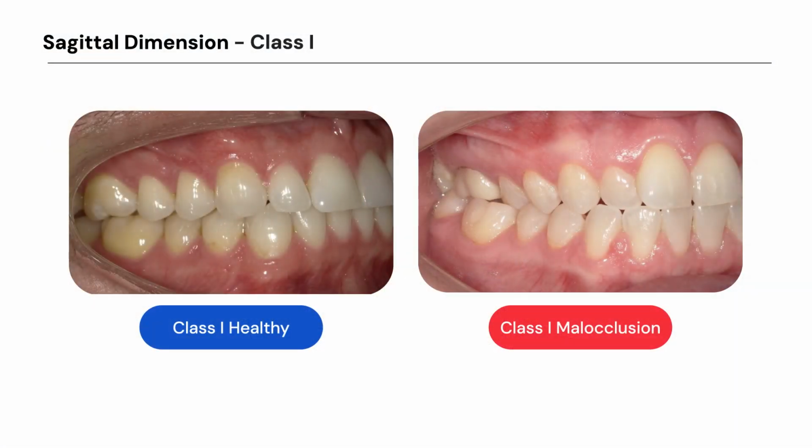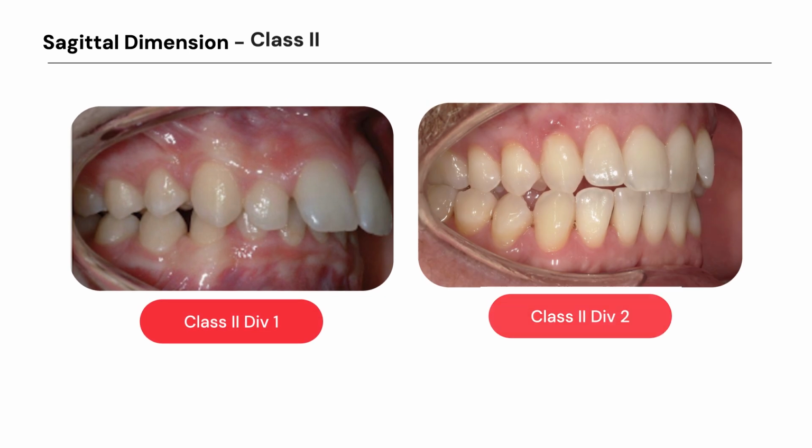The right side, different story there, right? We can see we definitely benefit from putting those teeth in a better position orthodontically. Super great, easy thing for us to accomplish with clear aligners, but not necessarily a Monday morning case, because there's a little bit going on in the posterior that we want to get our hands on. We'll talk about that a little bit later on, but let's talk about class 2 occlusion now.